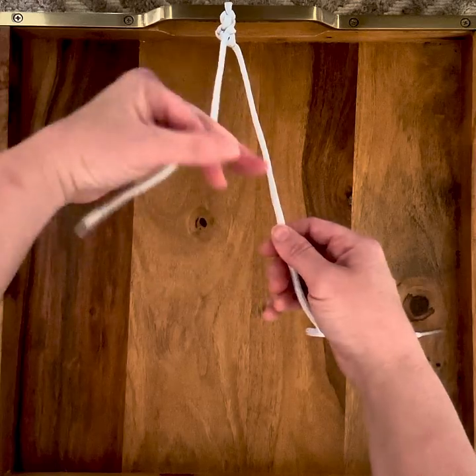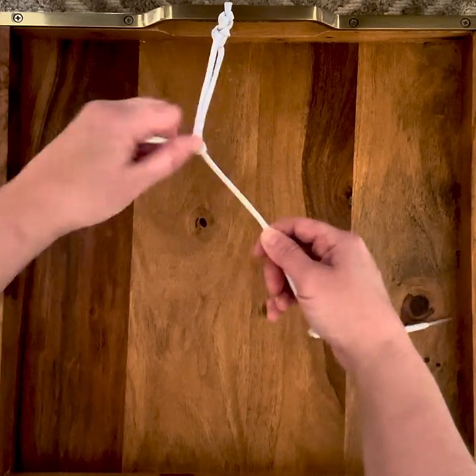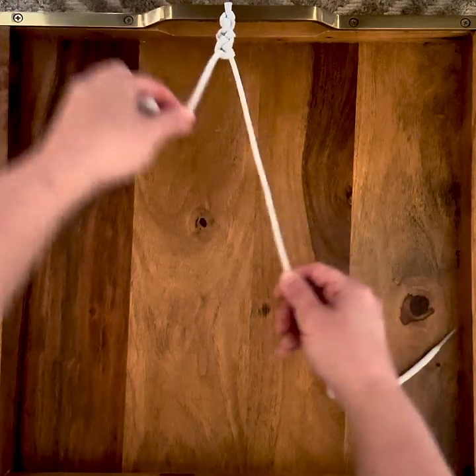Three fingers, chop from above, make that ladder, come around, pull through. Knot.